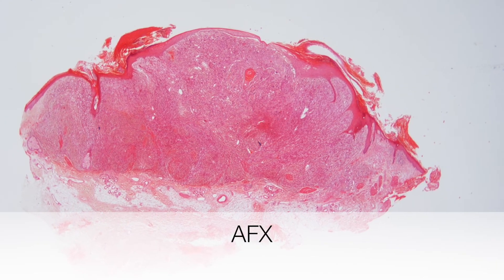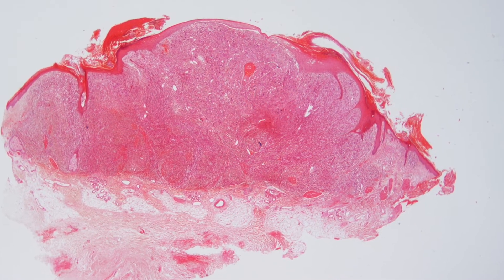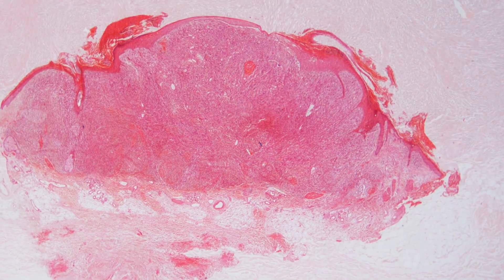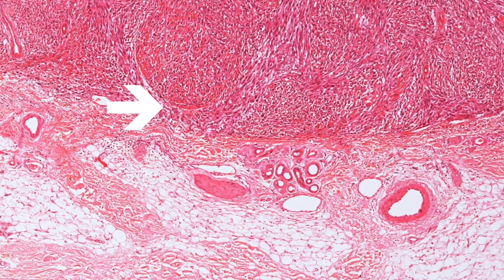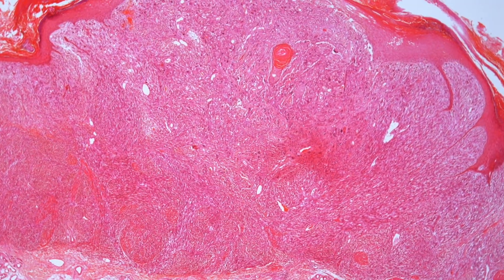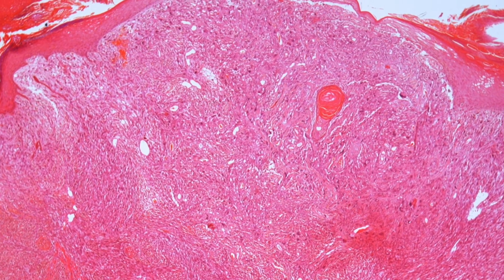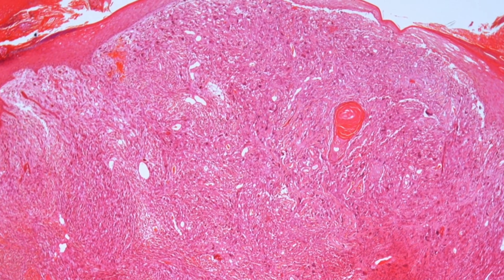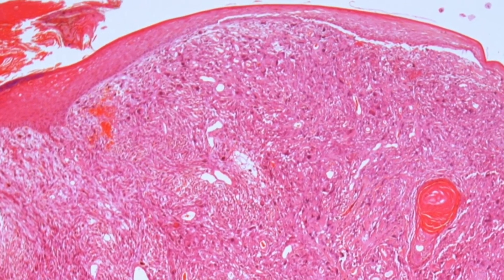This is a low-power view of an AFX. The lesion is polypoid. You can see how well demarcated the lesion is from the underlying dermis. Here, the tumour can be seen to almost abut the epidermis, but it is separate from the epidermis and clearly does not arise from the epidermis.